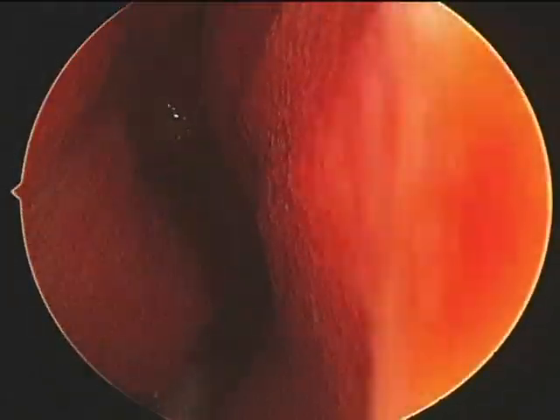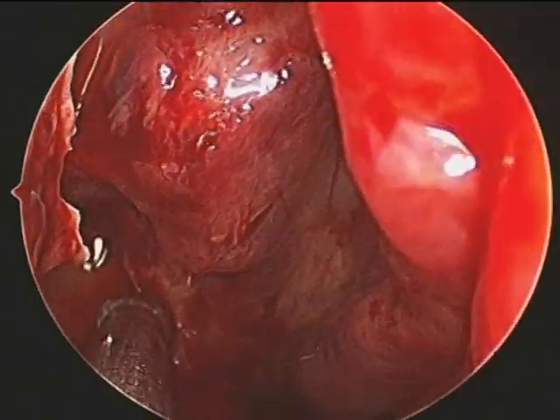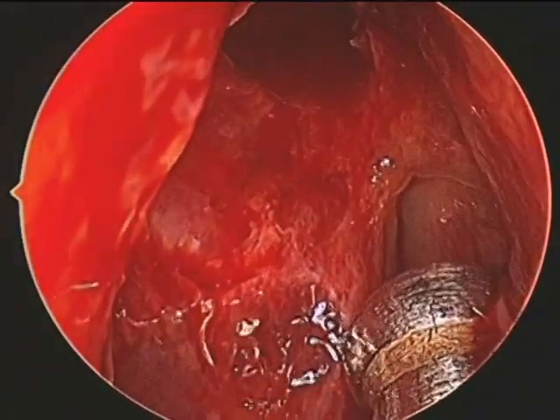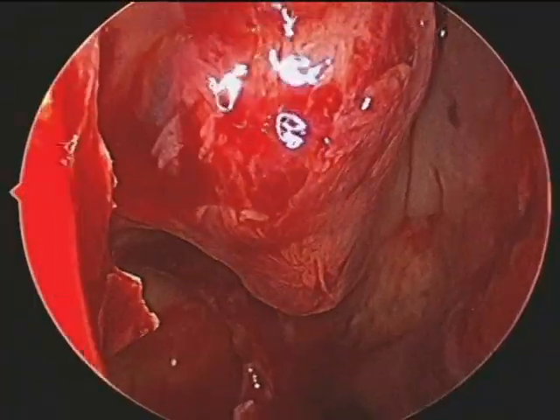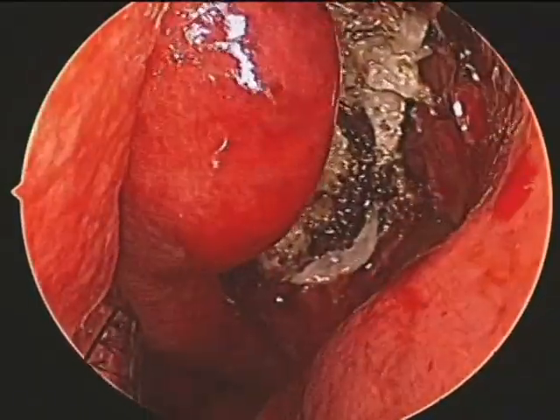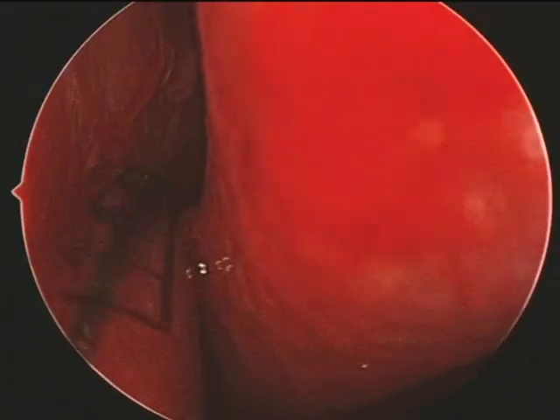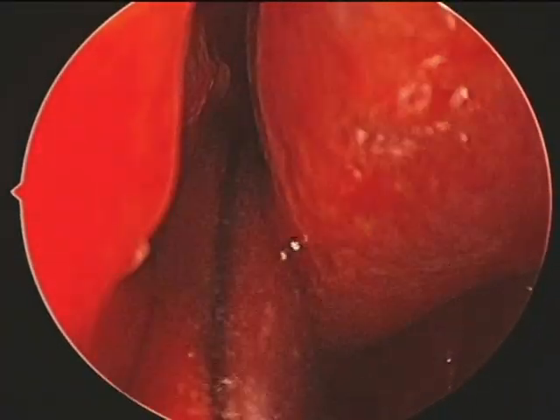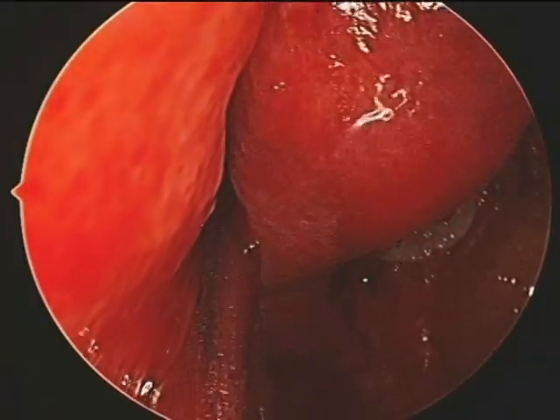Now on the right side — the inferior turbinate, then the right maxillary sinus, the face of the bulla ethmoidalis, the ground lamella, the hiatus semilunaris superior, the right frontal sinus, and the right frontal recess. Now on the left side, we also make raw the area between the middle turbinate and the septum so that we can medialize the left middle turbinate onto the septum, to create a clear surgical view for postoperative decrusting, inspection, and adequate postoperative steroid nasal irrigation.